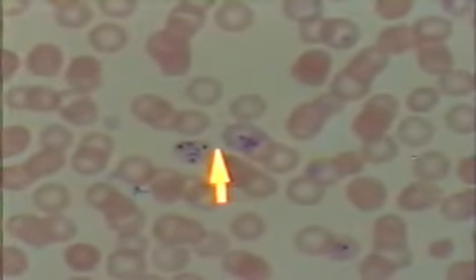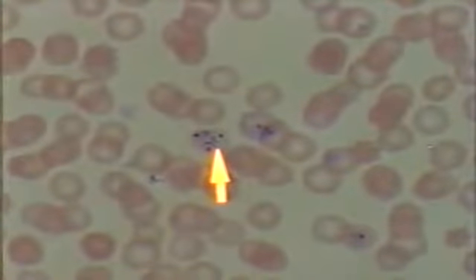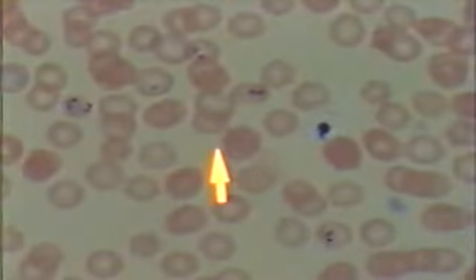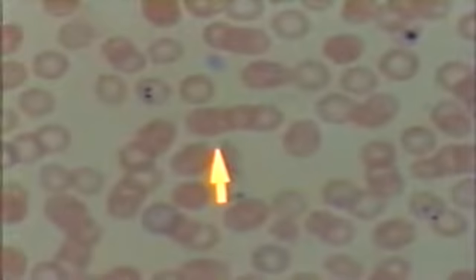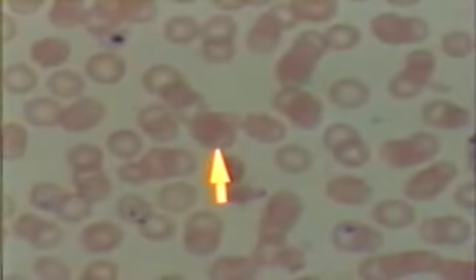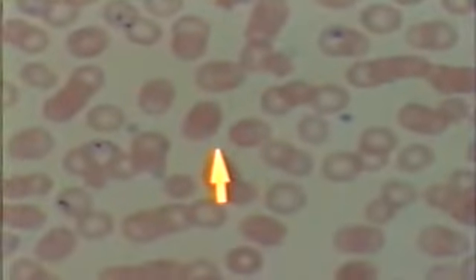the blood smear, what you'll notice is that there are numerous individual red blood cells that are infected with multiple parasites, multiple signet rings, and those could also be multiple schizonts in some cases. And so use that characteristic very carefully. You'll obviously need at least oil immersion lenses before you can even start to make those distinctions.